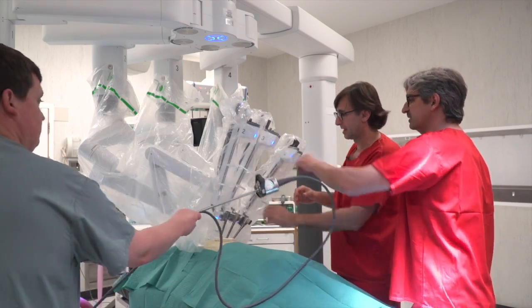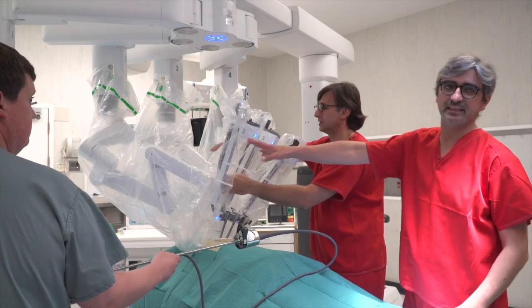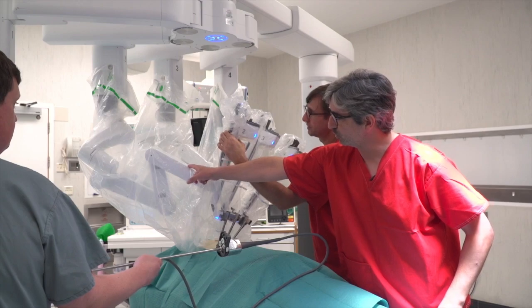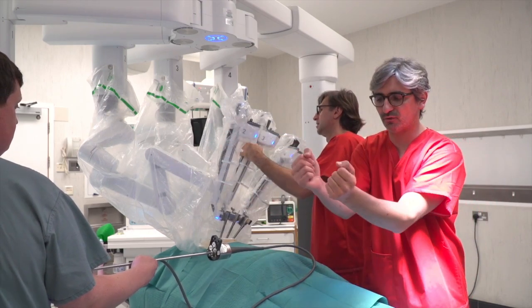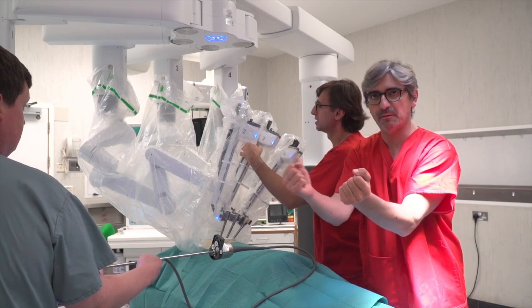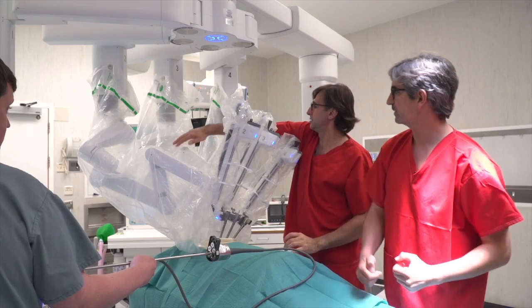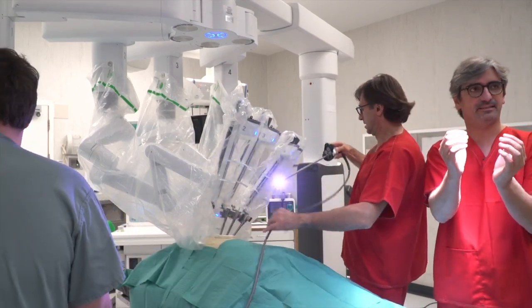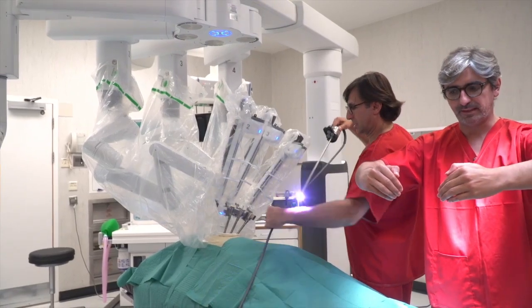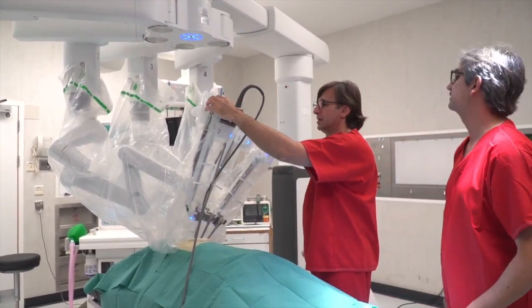Now the clearance — you see the clearance? We need to do clearance here. But the distance is good now. We need to show — move the arrow and have more space. Because if they are too close, there may be more collision. You have to go like this, to have the space here between the joints. You have to be sure that the clearance is always open. Not like this, otherwise we collide. You have to go like that.